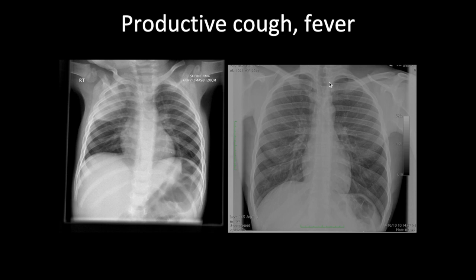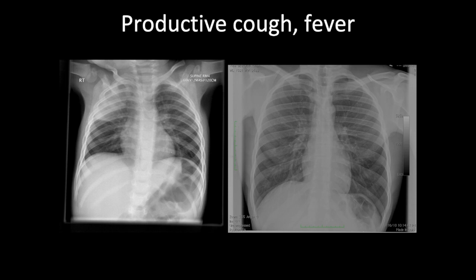So let's get to the lung now. This is a normal chest again for reference. There are two types of lung pathology: airspace disease and interstitial disease. Airspace disease represents alveolar disease. The dark density we see in a chest radiograph is a result of air in the alveoli. When there is no air in the alveoli, this air density disappears and becomes replaced by whatever has gone into the alveoli — for example, fluid, pus, any type of aspirate, or blood — giving you consolidation.